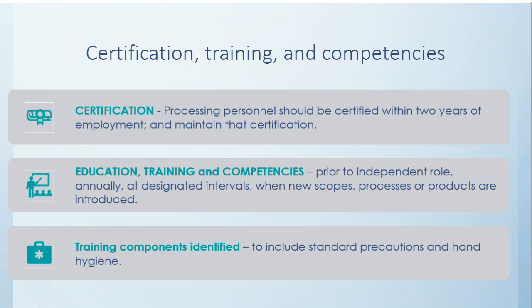Education, training, and competencies: we do state that prior to doing anything on their own, anyone that's processing endoscopes needs to have this education, training, and competency completed before they do any independent work of processing those endoscopes. You do that initially, of course, and then at least annually, as we do with our other trainings.